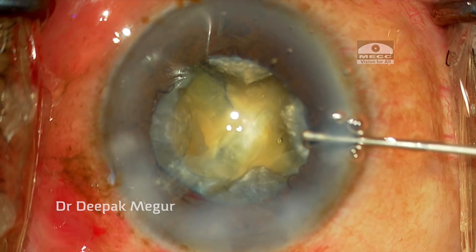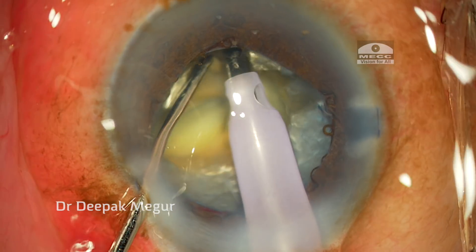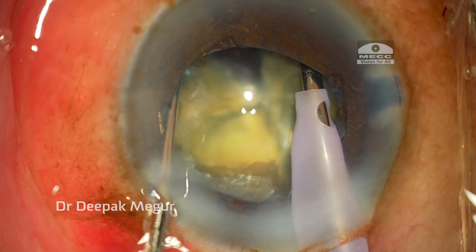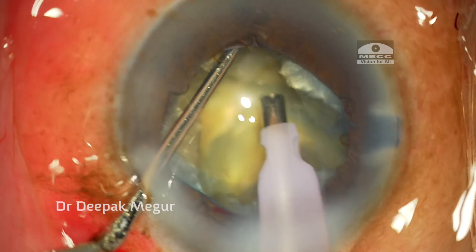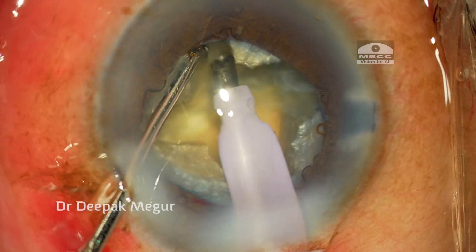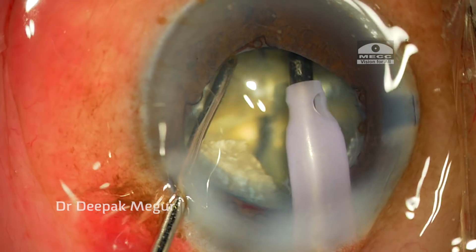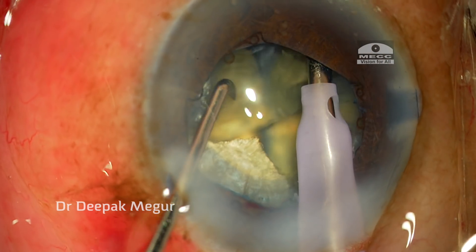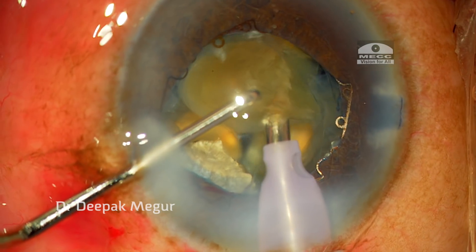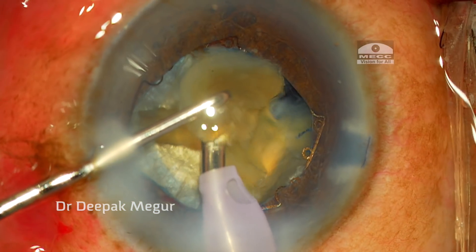Having separated all four fragments, we are left with four moderately large fragments. When emulsifying, I need to ensure they don't come too much into the anterior chamber. I try to stay as close to the pupillary margin and within the bag as possible by adjusting my parameters appropriately.